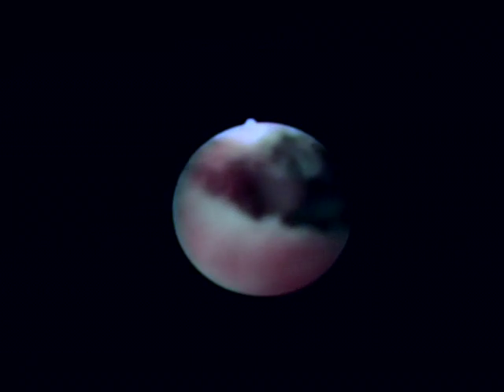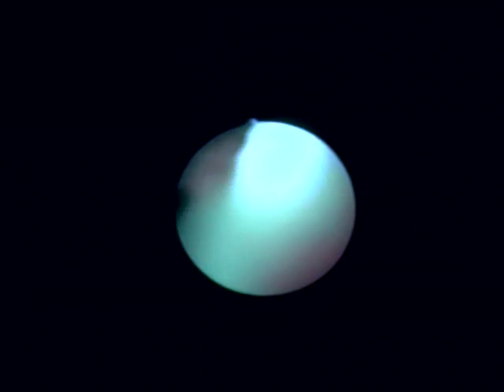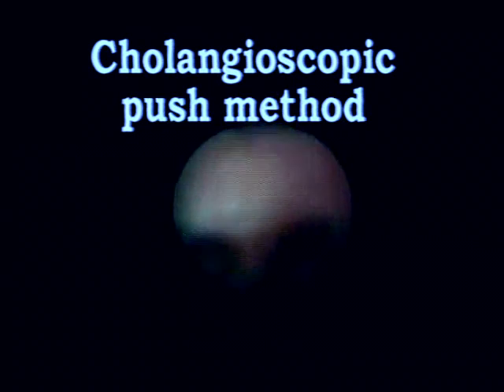It is not necessary to remove all the stones outside of the body. When the ampulla or choledocho-enterostomy site is patulous, small stones can be pushed into the duodenum or enterostomy site instead of removal from the body. This technique can be called the cholangioscopic pushing method.